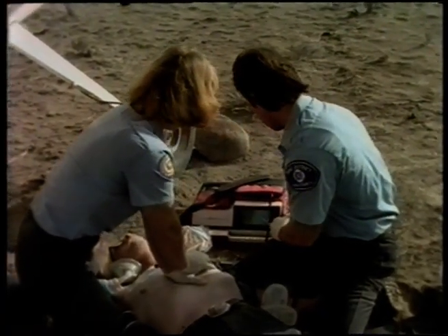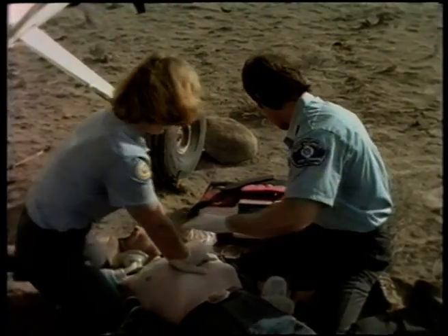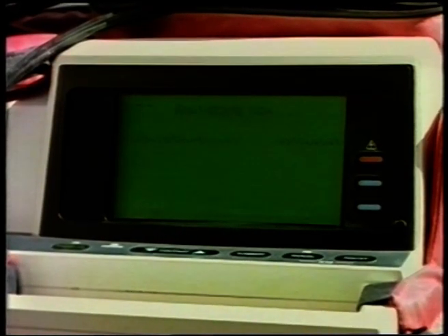At this time, stop CPR and make sure that everyone is standing clear of the patient. Push the lower display button labeled Push to Analyze. You will hear a stand clear voice prompt. The system takes from 6 to 9 seconds to analyze the patient's ECG. Do not touch or move the patient or the device during this time, as this may inhibit analysis.